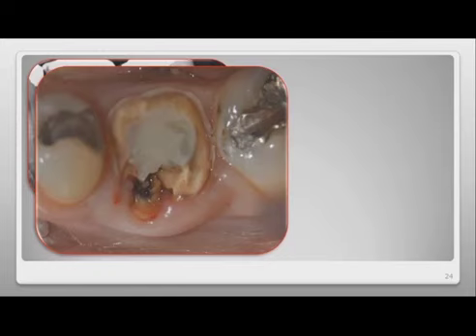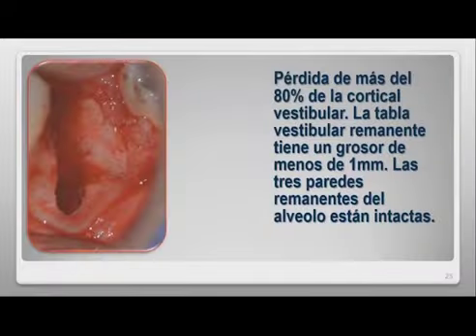On removing the filling, we can observe the occlusal clinical image that confirms the diagnosis of the loss of this tooth due to the lack of adequate restoration. In this image, we can observe the loss of over 80% of the vestibular surface. In almost all patients, the vestibular surface has very specific characteristics, with biological characteristics and/or specific formation, making this the most common in a range of situations. In this case, the lesion has destroyed the area and the work had to be carried out very carefully to preserve as much tissue as possible.